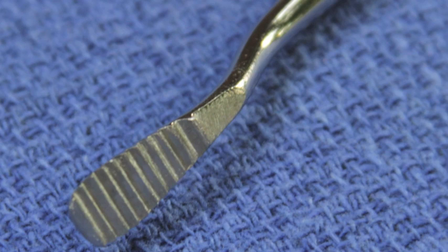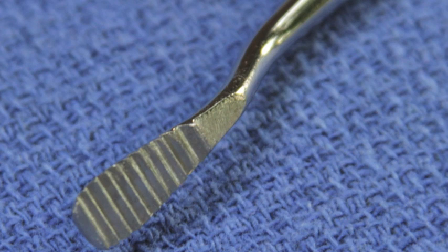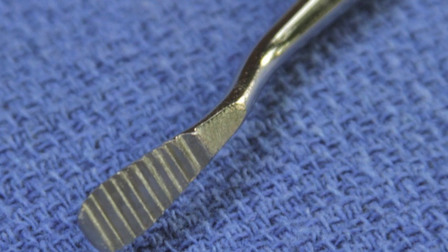What you see here is one end of a bone file. Bone files typically are double-ended instruments with a bone file on one end that is small and the other end is large. Their principal function is to smooth rough edges of bone. One thing for the assistant to bear in mind as he or she works with the bone file: when the surgeon hands it back to you, there will be little pieces of bone and blood found within the blade of the bone file. Take a 2x2 and clean this out before it has a chance to dry.